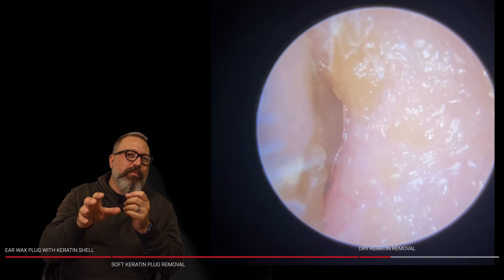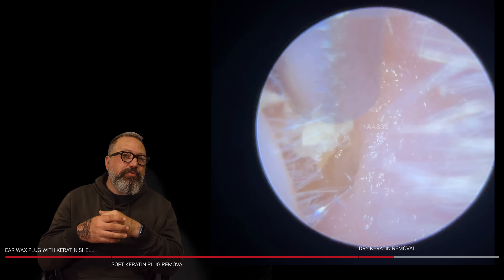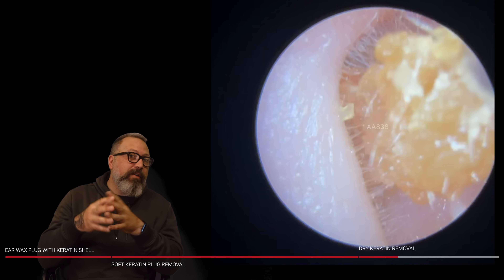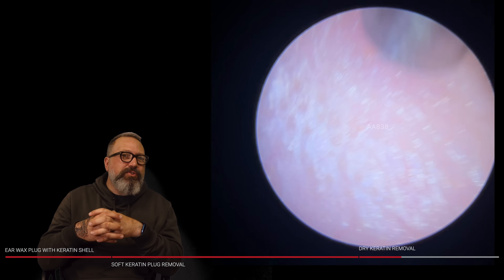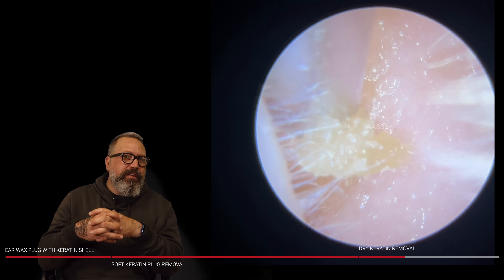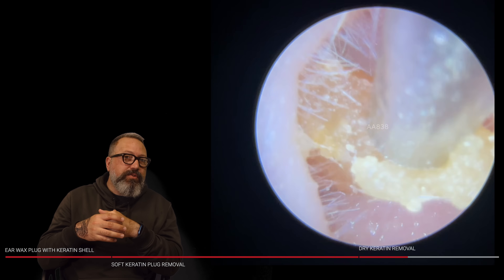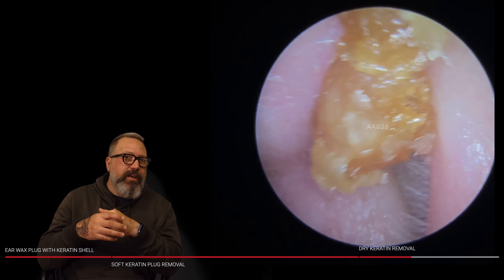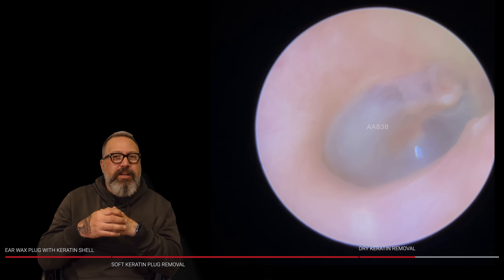This is really, really hard, chunky wax. Narrow ear canal as well — this is the standard size on the tube in here. I'm having to negotiate two bends just to get this out: the first bend just inside the ear canal, and then around the outer portion of the canal. This is dry wax, dry keratin. I think the patient probably did try to soften their wax, but the canal entrance is so narrow the oil they used probably just sat on the surface. This is coming away very nicely though — out it comes, get that blob around the corner. Look at that eardrum — lovely and shiny there.